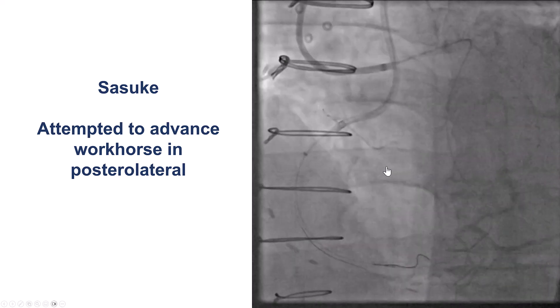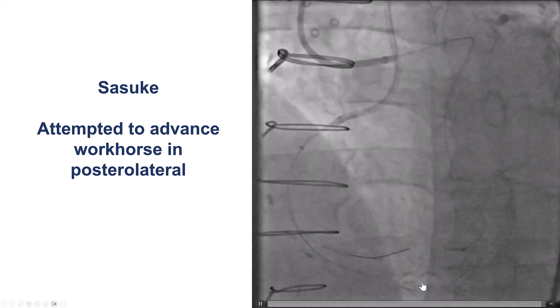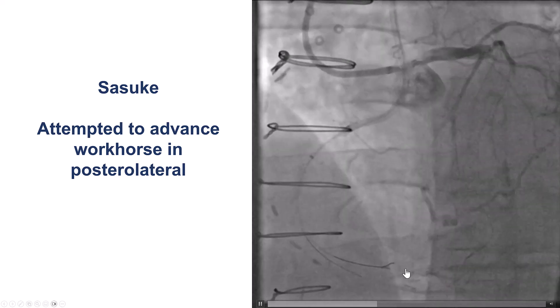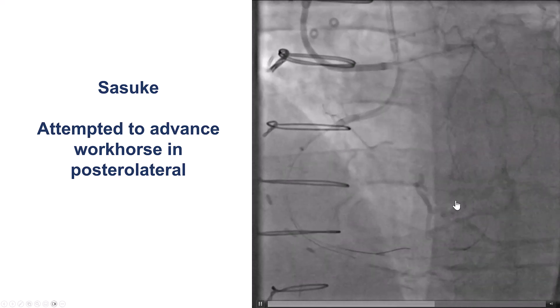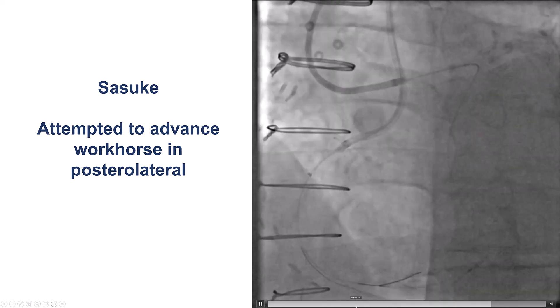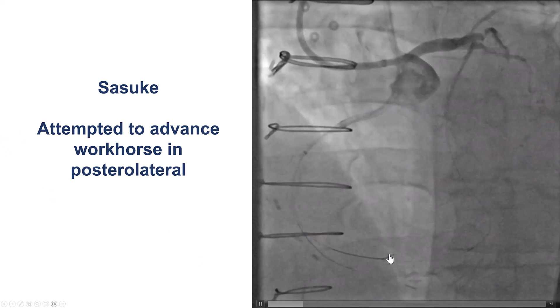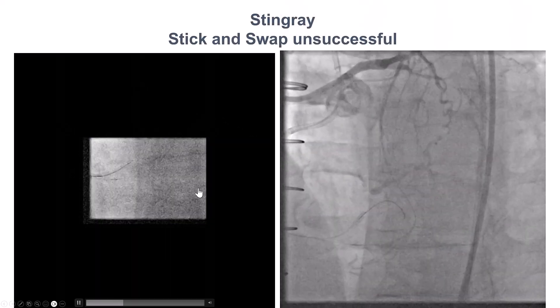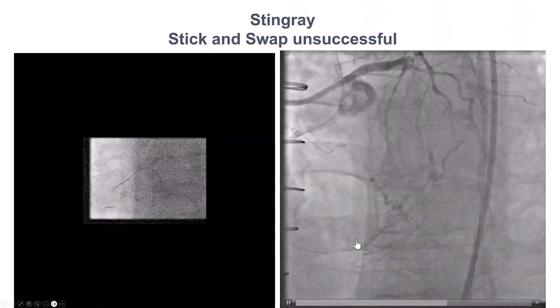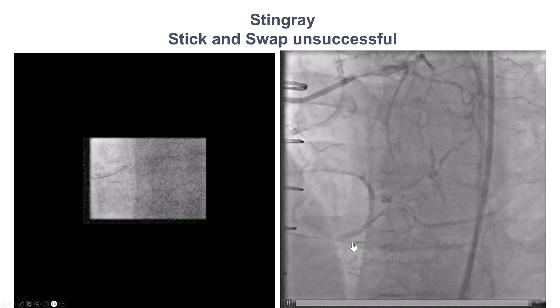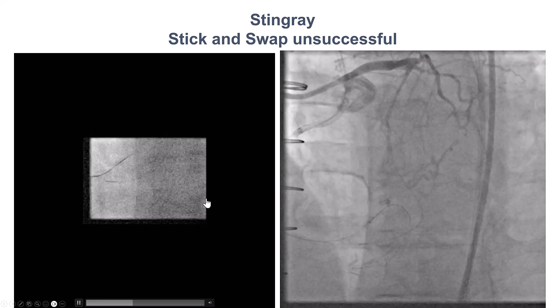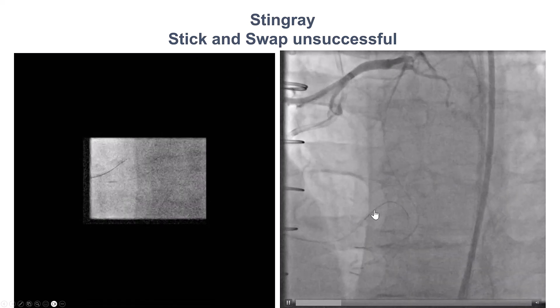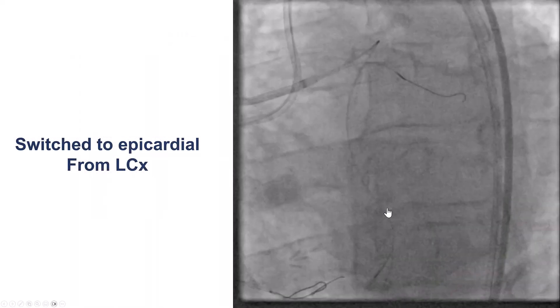We then externalized the guide wire. The next step was to try to secure the posterior lateral. The patient did have a large right posterior lateral, which was filling through the epicardial mainly. We did try a workhorse wire, but we had a lot of difficulty getting into the posterior lateral, and it turns out we were in the subintimal space. We ended up delivering a Stingray balloon to try to reenter, but despite multiple attempts with stick and swap, we were not able to cross into the true lumen.